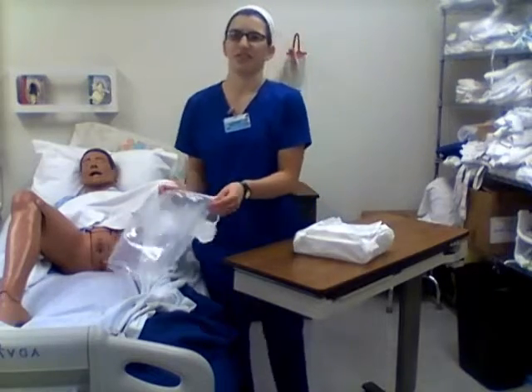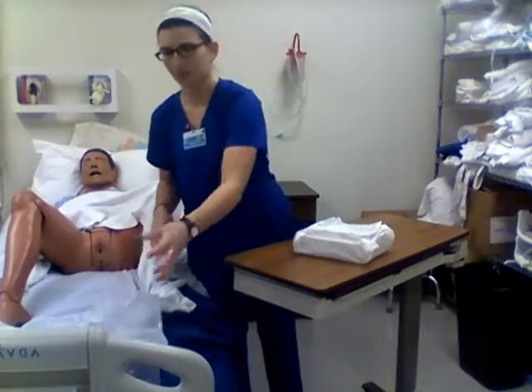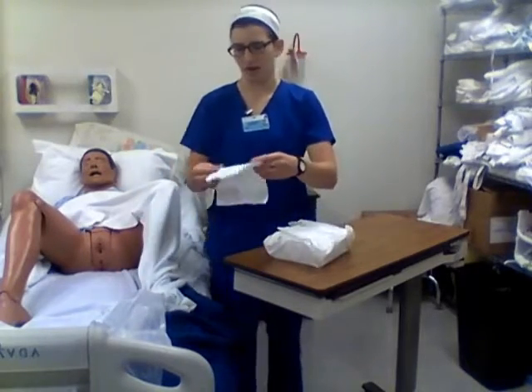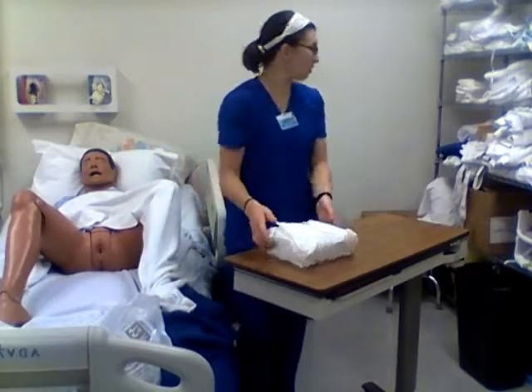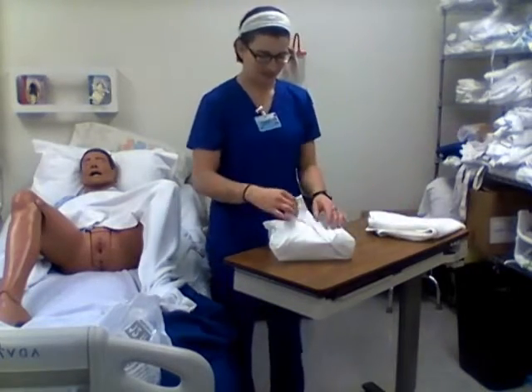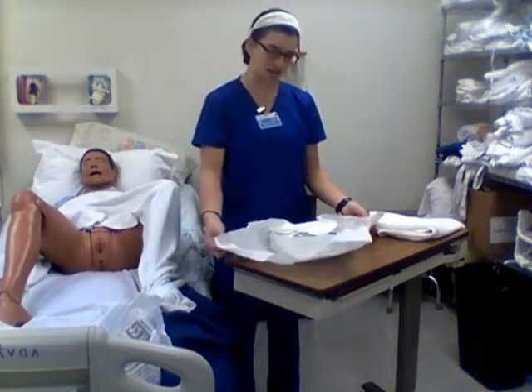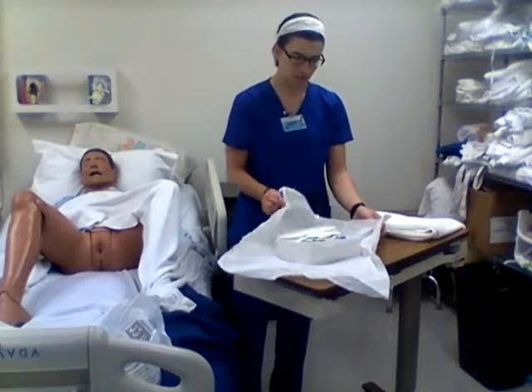We're going to roll it up, use this as a trash bag. You don't have to, but it's just easier and it makes sense for me. All right, so throw away our top. All right. Get my towel back. All right, and this is sterile, so we're going to open it like a sterile packaging, so we're not going to touch the inside. Keep everything clean.